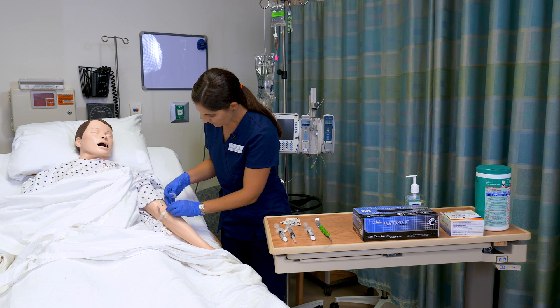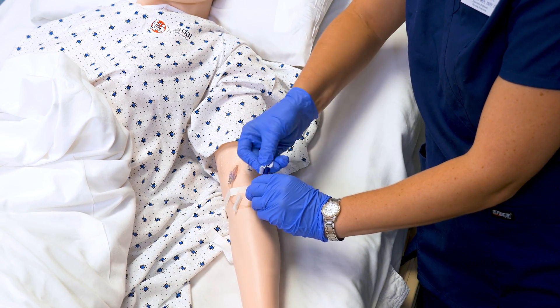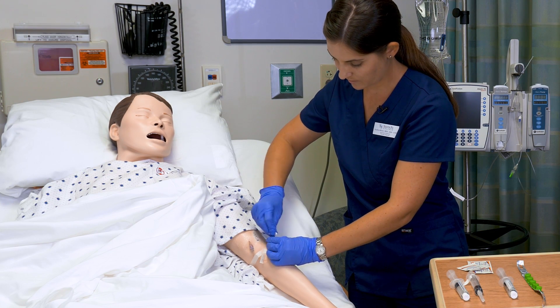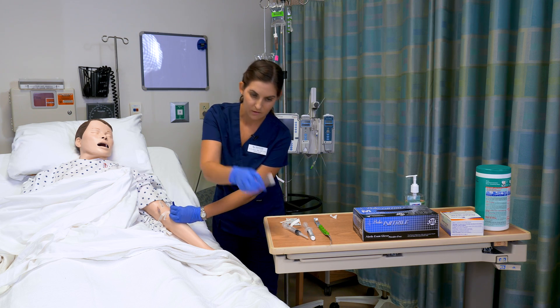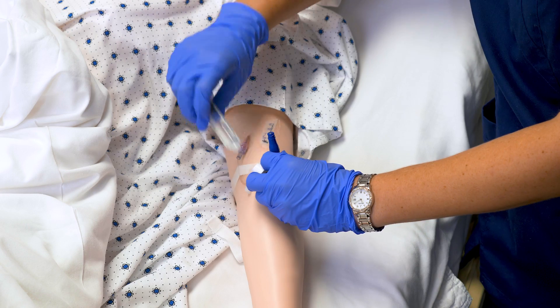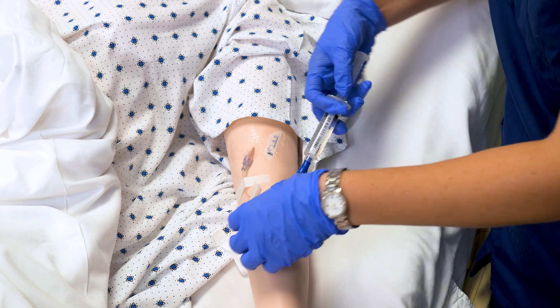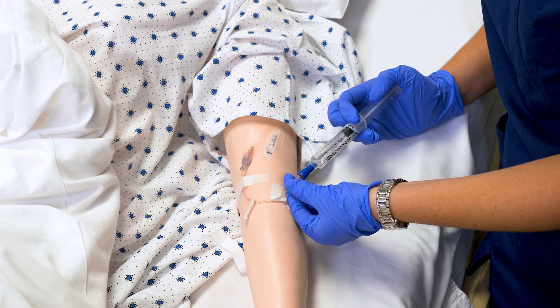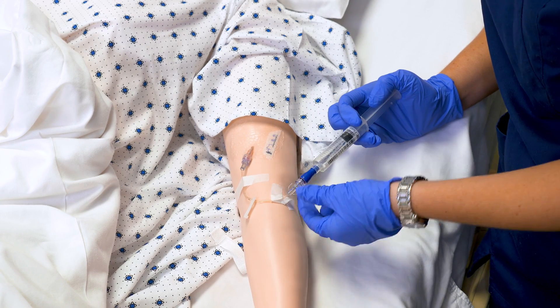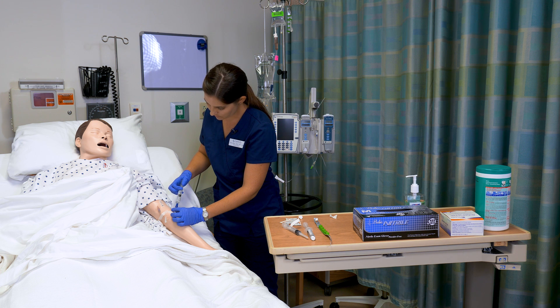My IV is clamped at the moment. I'm going to scrub the hub for 15 seconds. It is important to have a watch with the second hand when administering IV push medications. I'm going to unclamp my line and flush with the first five mLs. Observe the IV site — I do not see any redness or irritation. Doing a slow push because the peripheral IV is in a smaller vessel.